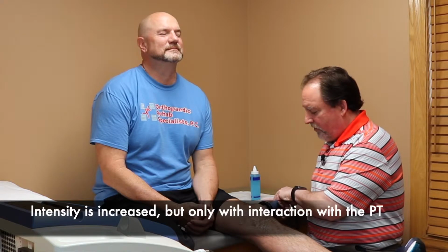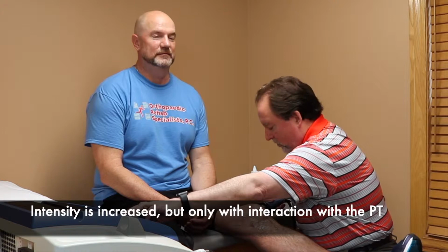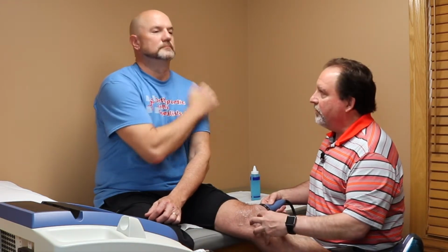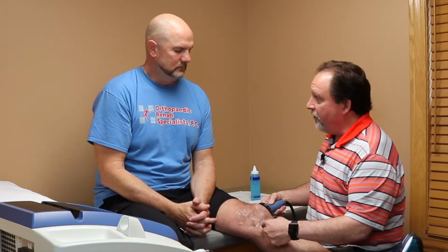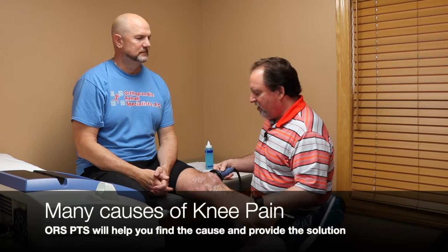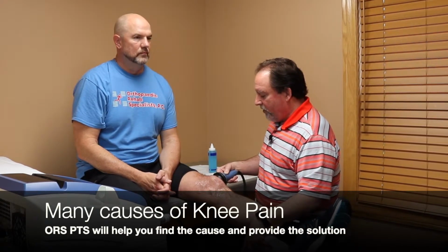Another thing we find, people say, back that down. No problem. Another thing, people can say, my problem is here, my problem is here, but we'll find something over here. Sometimes you can feel it there. Sometimes you'll do here, feel it here. But they're somehow related. There's something going on over here that can be causing a pain over here. So inside you may have a scar, an old injury. This will help us locate it.